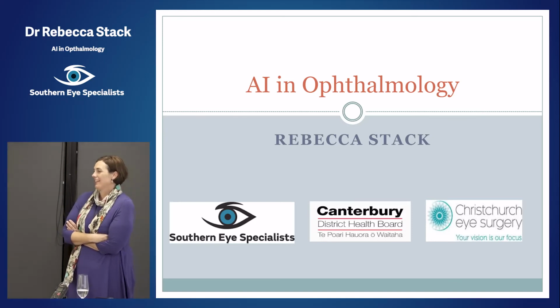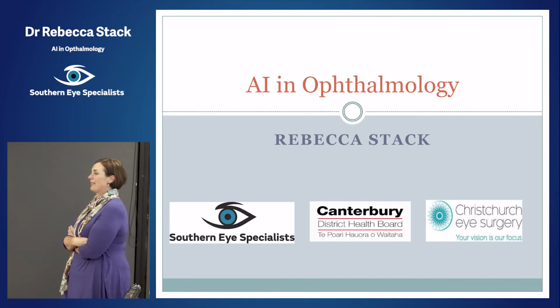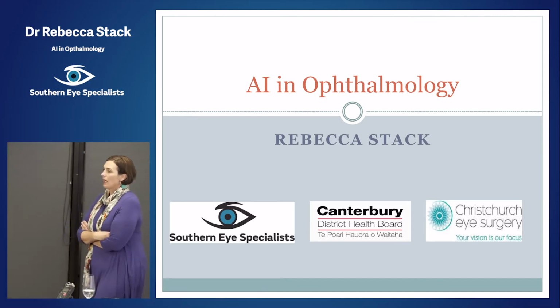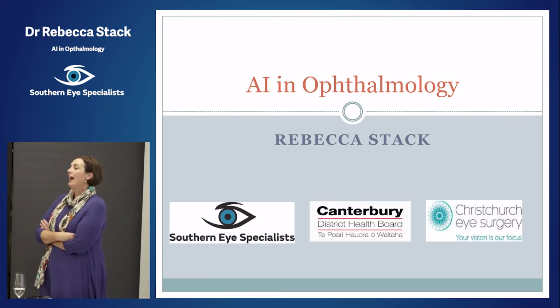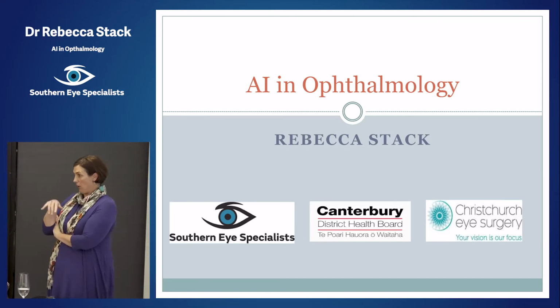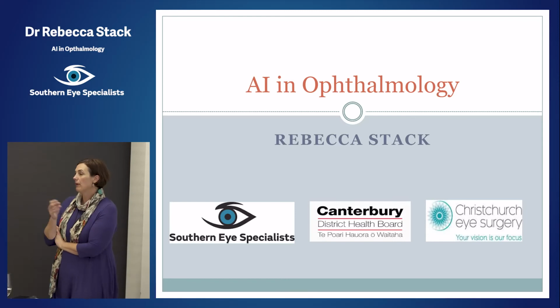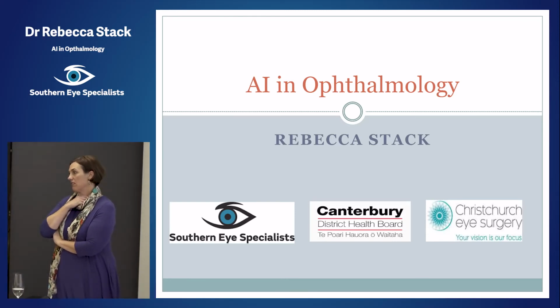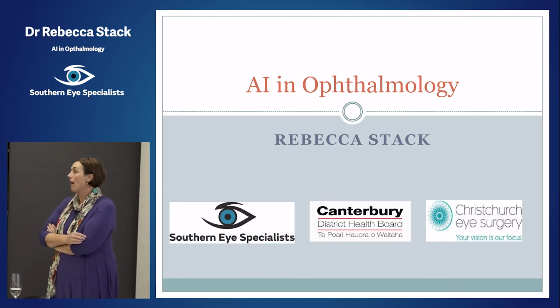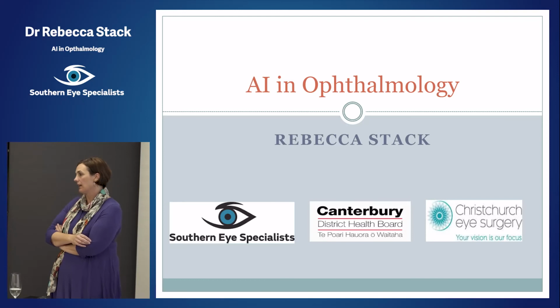Yes. So we're really good at obviously manipulating these robots and getting them to move really slowly, but when we get the patient to lie equally still. Right. Completely knocked out. Well, what we do now, so we used to, but now for vitrectomy surgery and even epiretinal membrane peels, we do it under an eye block. So we immobilise the eye, so it can't move, blink, the patient can't do anything.